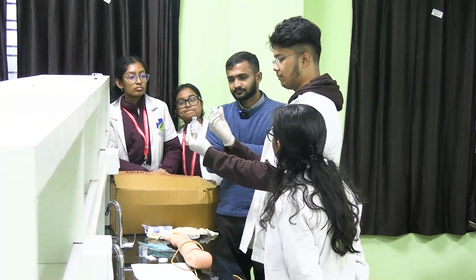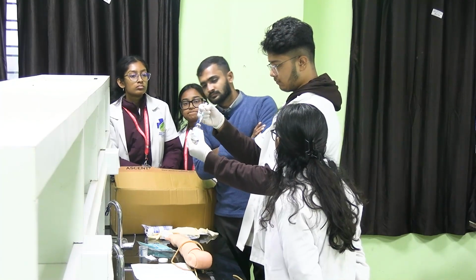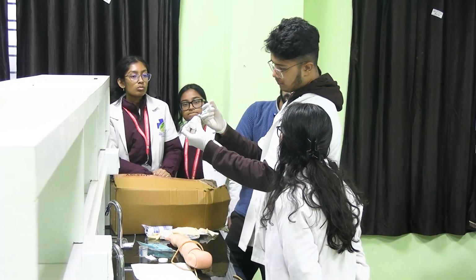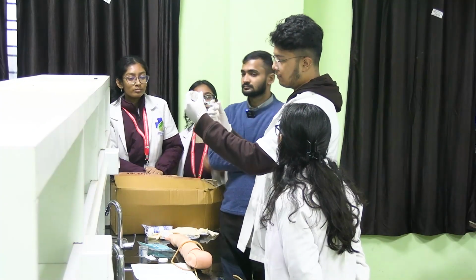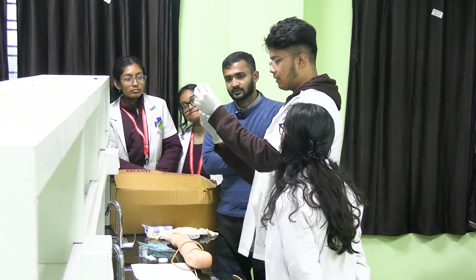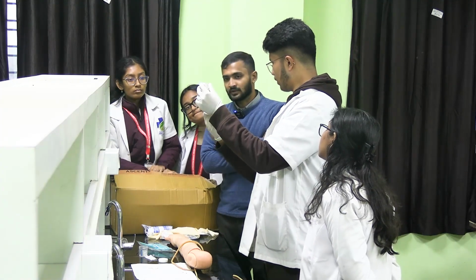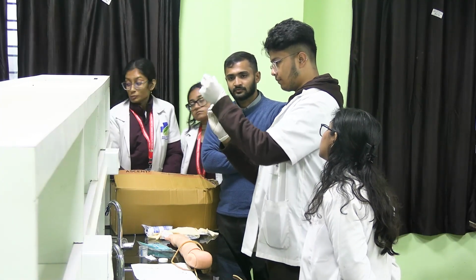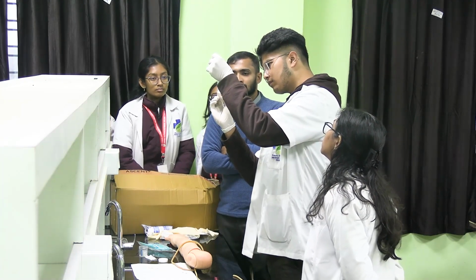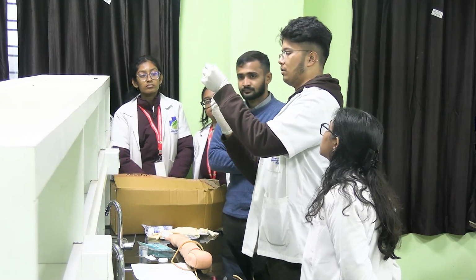How will you take? Okay. You can do it any way. You should introduce it, okay? Either up or down. Preferably you should do it by lifting, okay? Opposite direction. Then, how many ml will you be taking? 1.1, sir. Yeah. Ready.